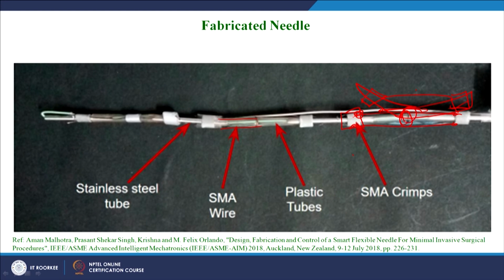So this is the actuation with the SMA actuator wire. The SMA actuator wire is the nitinol wire which we have used, basically a combination of nickel and titanium.